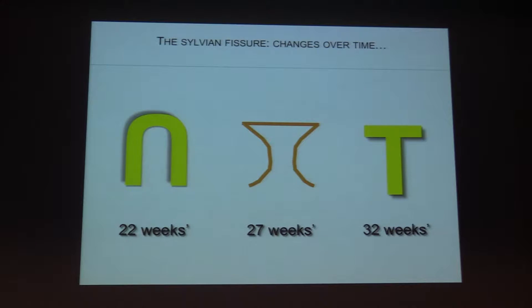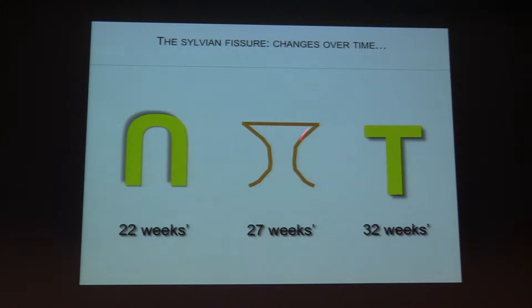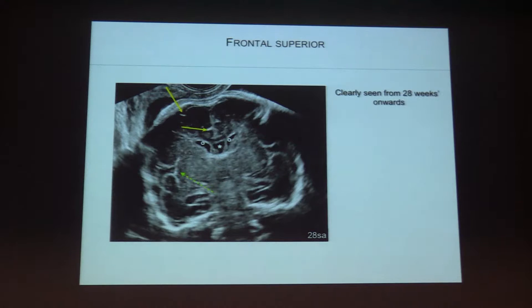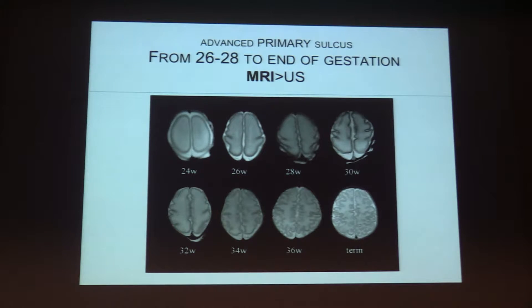At 32 weeks, we have the particular T-shape of the Sylvian fissure. The term of 27–28 weeks of gestation is very important because it is the turning point of this fissure — the moment when you can be sure the Sylvian fissure is normal by its typical shape. Before 28 weeks, ultrasound is sufficiently reliable to assess all fissures correctly, but after 28 weeks MRI will be better.